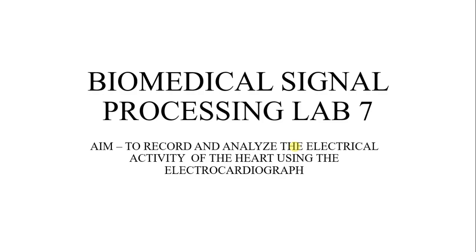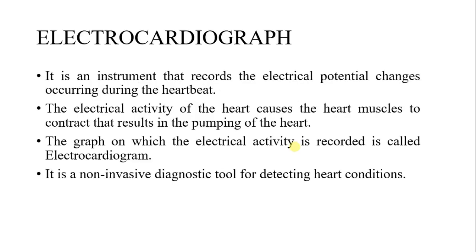The aim of this experiment is to record and analyze the electrical activity of the heart using the electrocardiograph. So, let's get started. The electrocardiograph is an instrument that records the electrical potential changes occurring during the heartbeat.